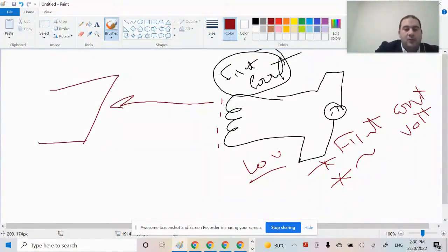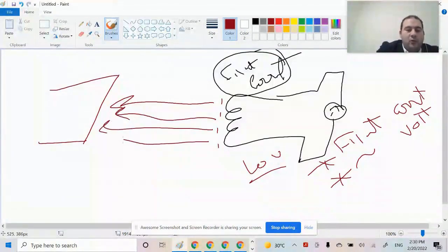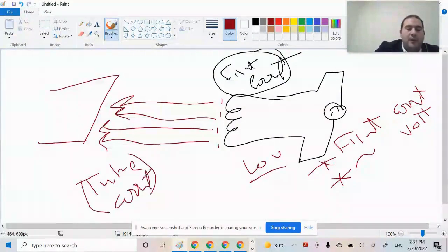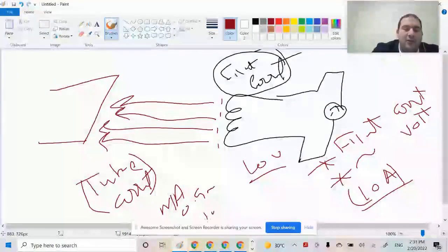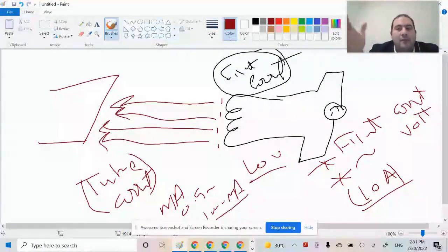Now, these electrons move from the cathode to the anode, and their movement creates a current, which is called tube current, and its value is measured in milliamperes. While the filament current is measured in amperes, the maximum value can reach around 10 amperes, which is very high. As for the tube current, it ranges from 0.5 milliamperes to 1000 milliamperes.